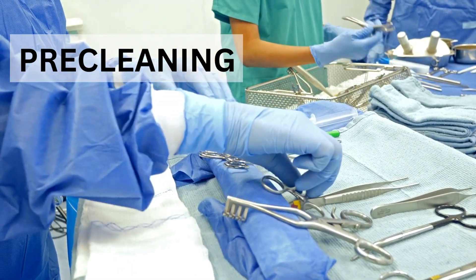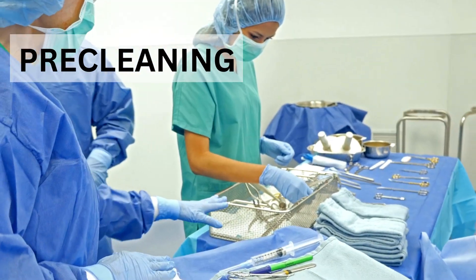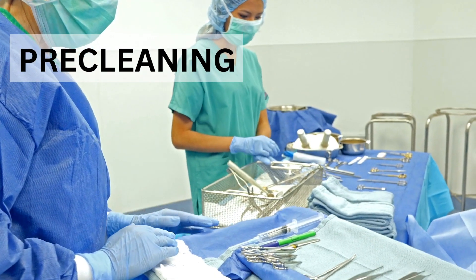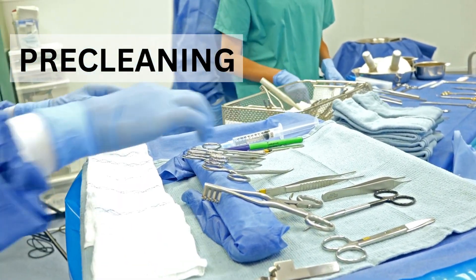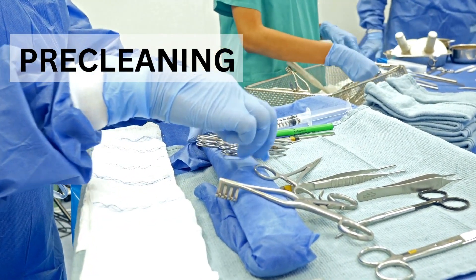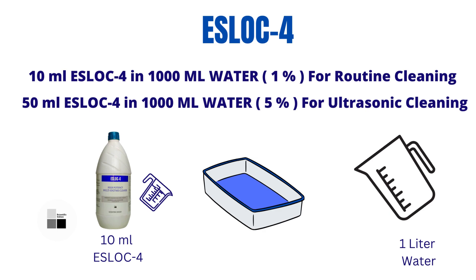The pre-cleaning process basically involves cleaning the laparoscopic instrument with water, followed by soaking the instruments in an enzymatic solution. There are multiple multi-enzyme cleaning solutions available in the market for cleaning these kinds of instruments. We recommend ESLOC-4 multi-enzyme cleaner for this job.